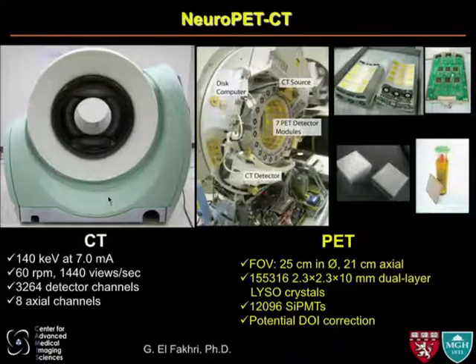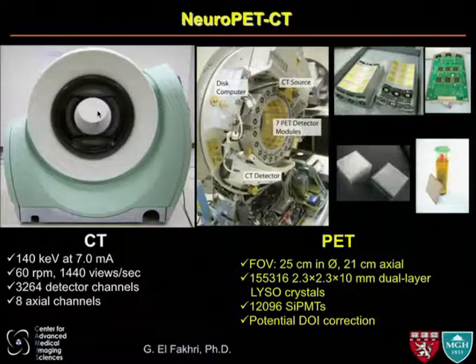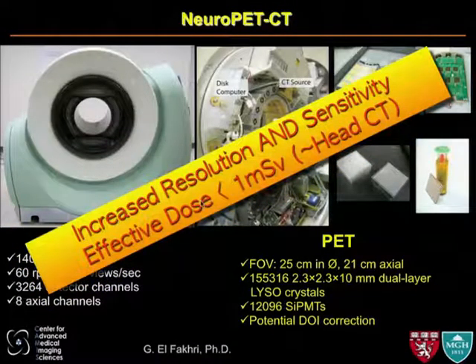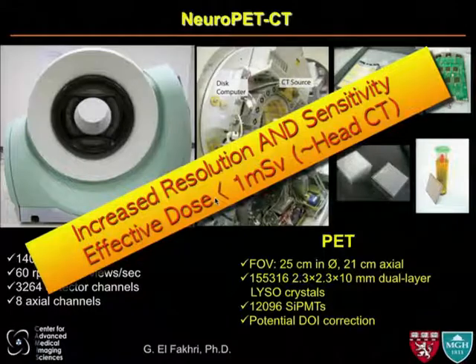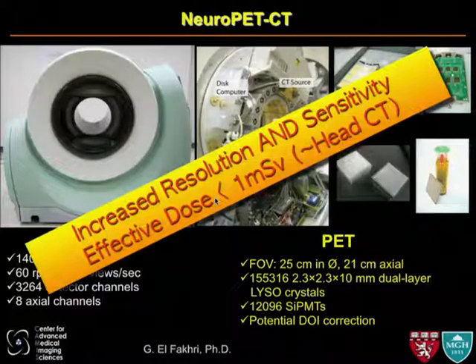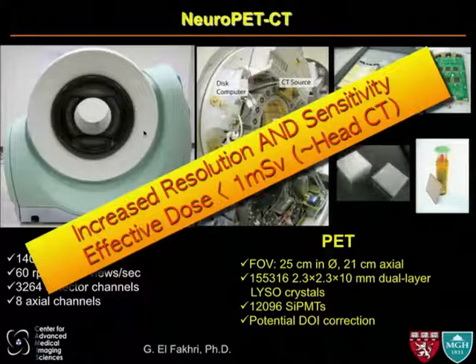There are new PET scanners coming out that have small bores, and similar to MRI and MEG, if you get those detectors closer to the organ, then you need less dose. In these new systems, the effective dose is at picomolar concentration, so it ends up being less than 1 millisievert, less than what most CTs are. And I think that can be pushed probably a little bit more. Once we're in that minimal risk, as long as there's a potential for gain, I think things might start happening in this area again. So keep an eye out for this.